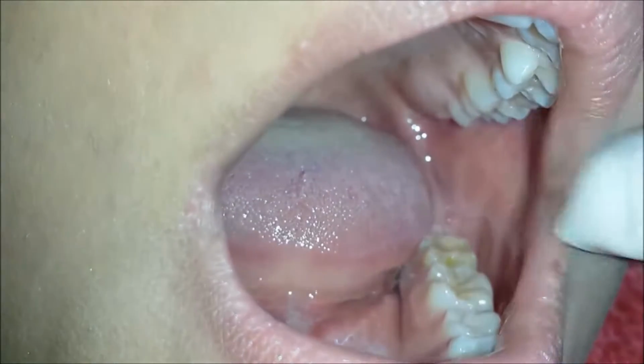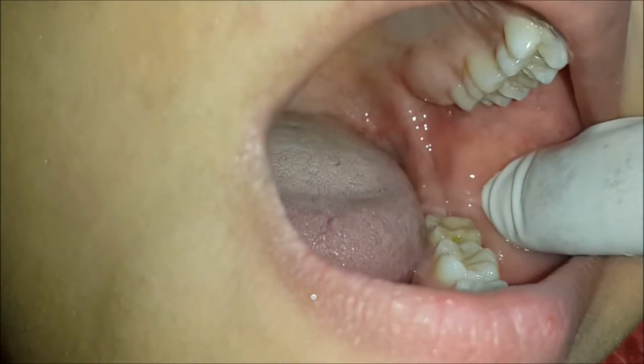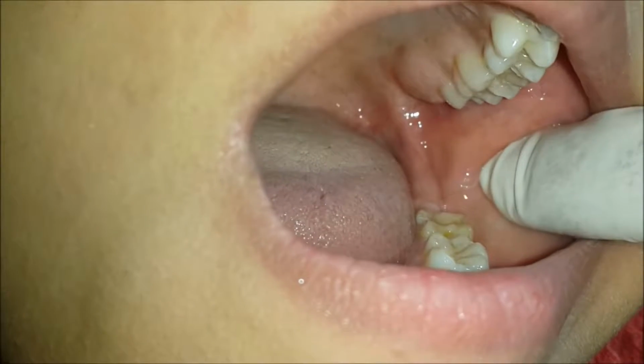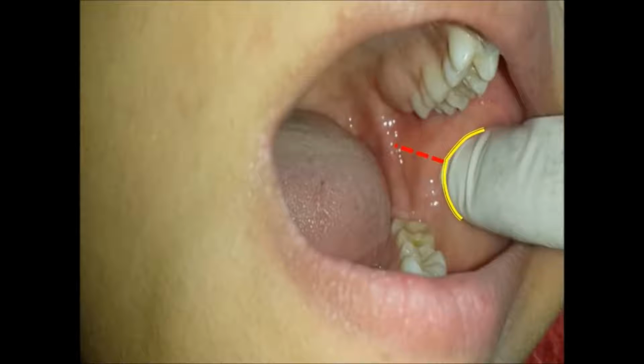The patient is asked to open her mouth wide. The coronoid notch of the anterior ramus of the mandible is palpated. As noted earlier, the height of the injection coincides with the height of the fingernail tip.